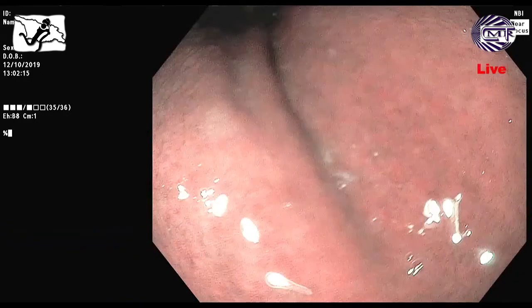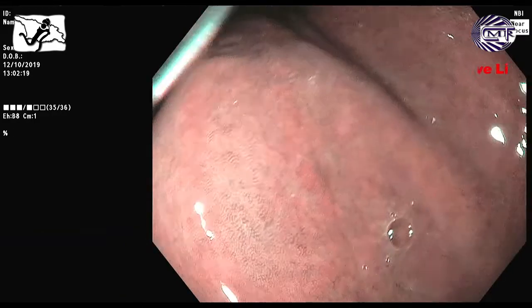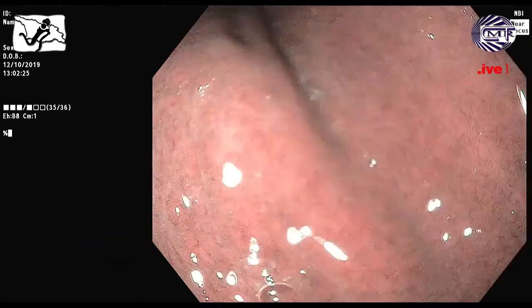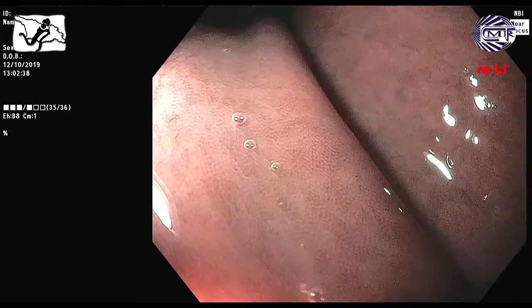Usually the human gastric wall of body is like small hole shape, but this patient is 60 years old. Yes. 60 years old lady, and patient gastric wall was changed to chronic atrophy and intestinal metaplasia like this.